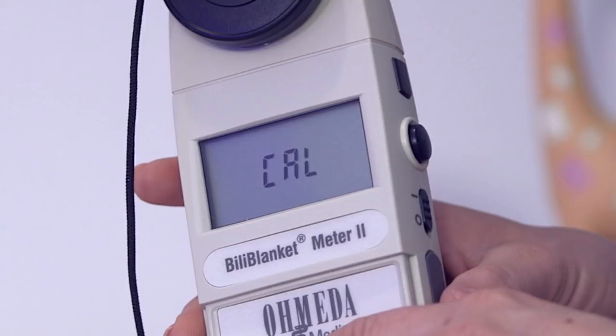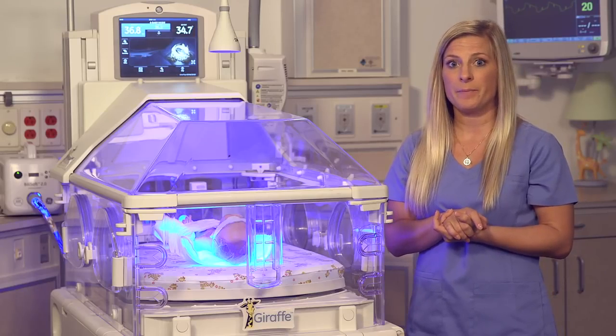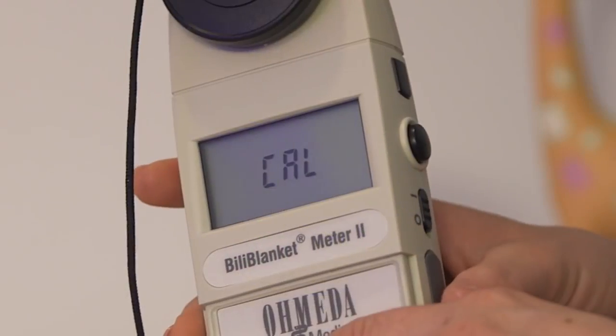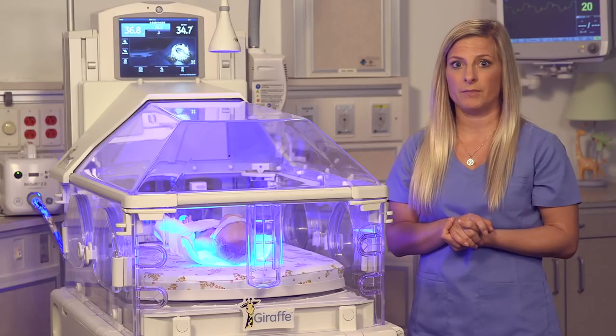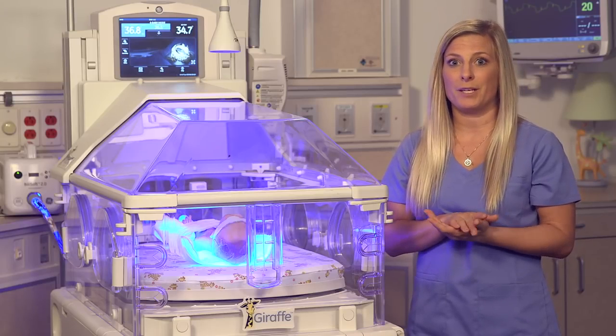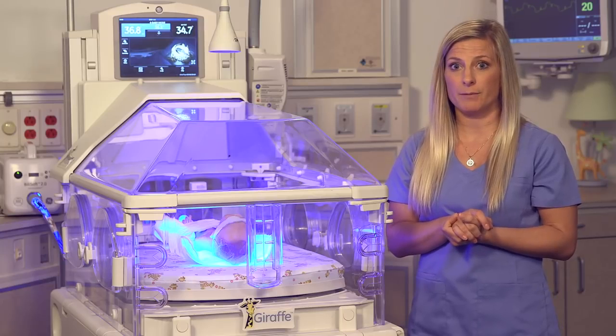You'll see that CAL will be displayed during zero adjustment. Zero adjustment is performed electronically, so no cap is required. When zero adjustment is complete, the CAL message will disappear. Just remember, when you're doing this, make sure to keep the meter still. Do not subject the BiliBlanket Meter 2 to shocks or vibration, especially at the time of zero level adjustment.